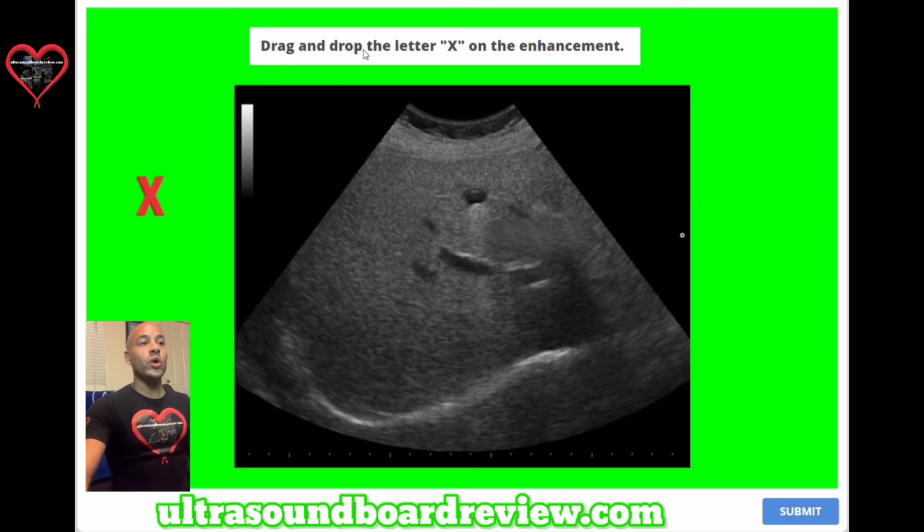Question 34. Drag and drop the letter X on the enhancement. So where would you put this X on your image? The answer is right here, caused by that little cyst. So you'll take this X and put it anywhere along this line. I'll just put it right there. Actually, I'll put it right there.